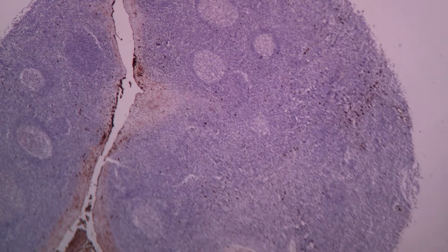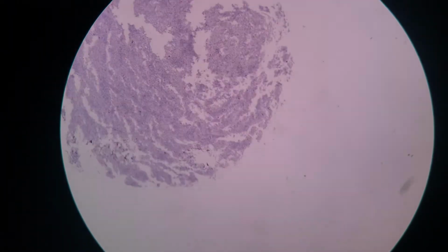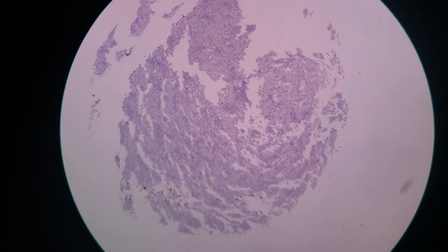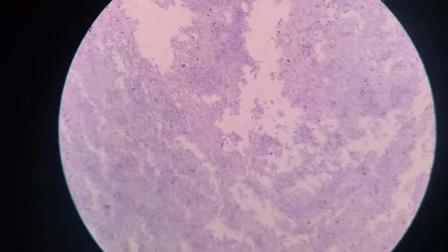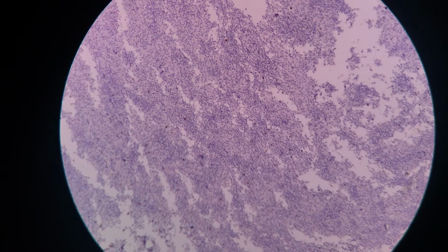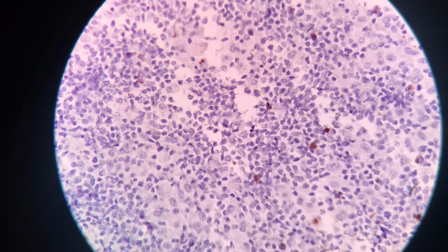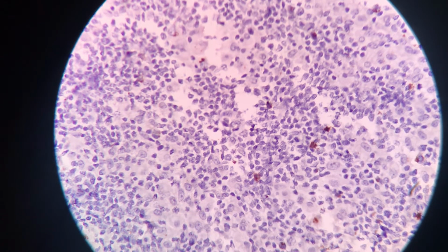And let us see the last case, or rather the first case in the provided sections, that is a lymphoma. This case was kept with a purpose. In this case we were not able to decide whether to call it a Hodgkin lymphoma or a non-Hodgkin lymphoma, and we just wanted to see how things take shape when rotated amongst the different participants.